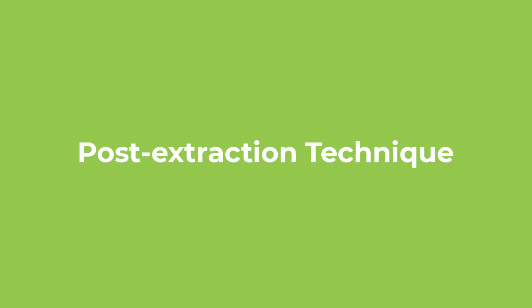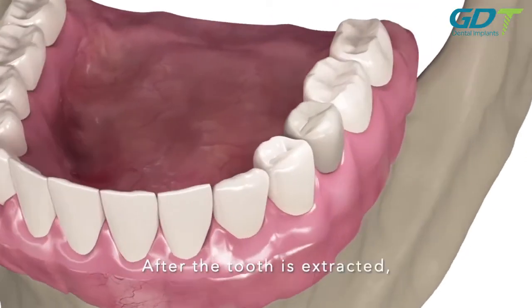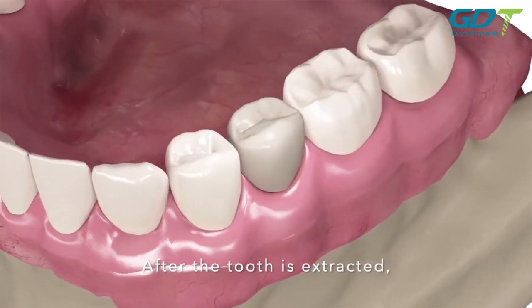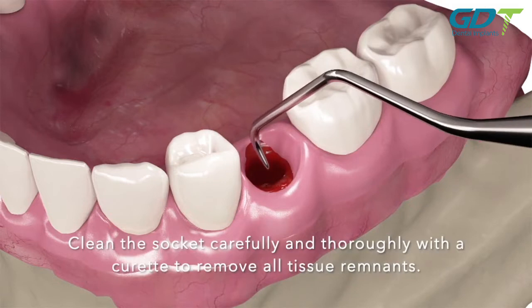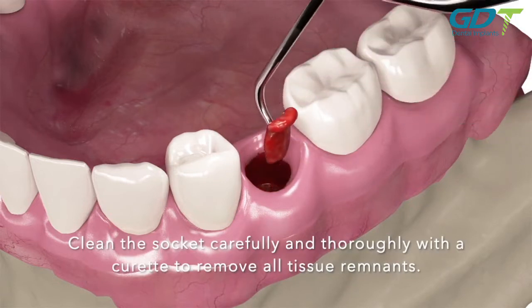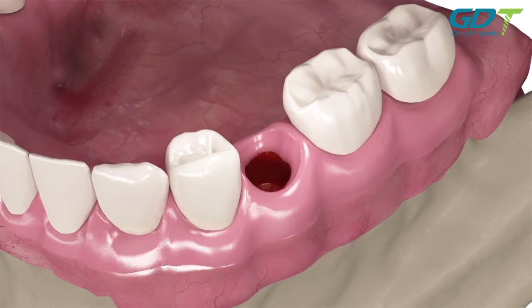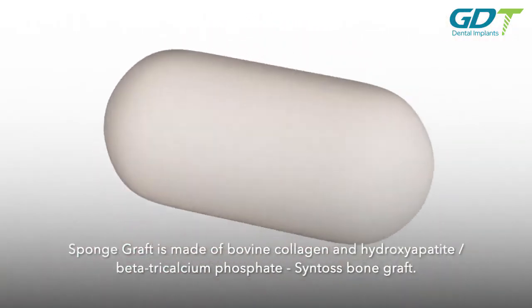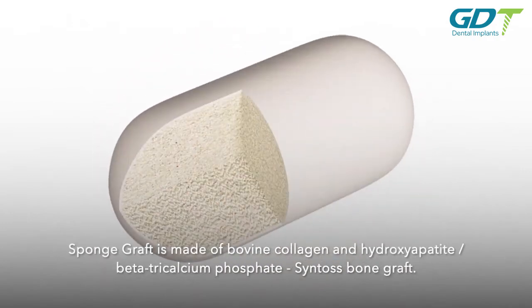Post-extraction technique: after the tooth is extracted, clean the socket carefully and thoroughly with a curette to remove all tissue remnants. Sponge graft is made of bovine collagen and hydroxyapatite beta-tricalcium phosphate granules.